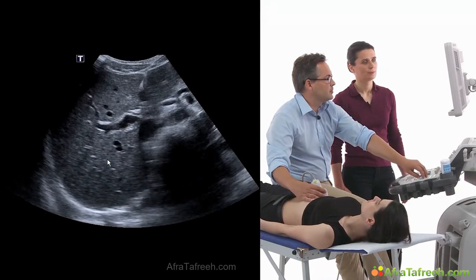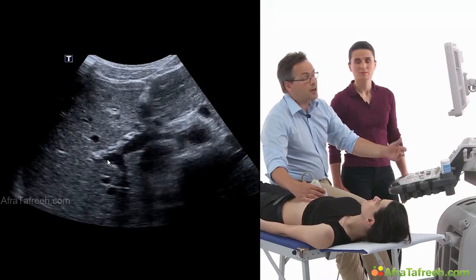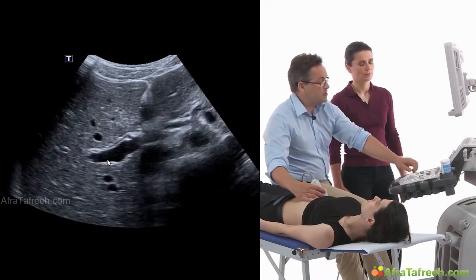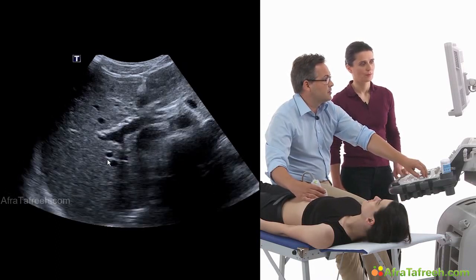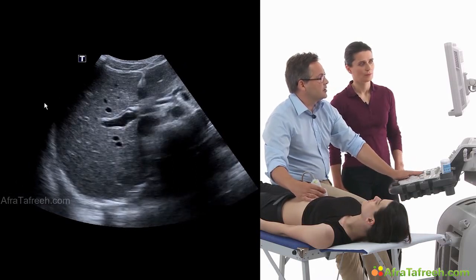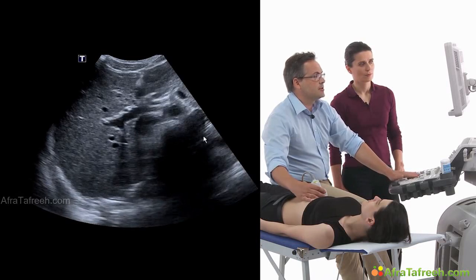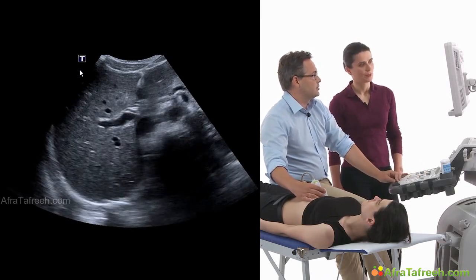But we have to be careful not to magnify the picture too much, because now I cannot see all the borders, so I have to reduce the size of the picture, and now I can easily detect the diaphragm over here and all the borders of this organ. So I think that's the best adjustment.